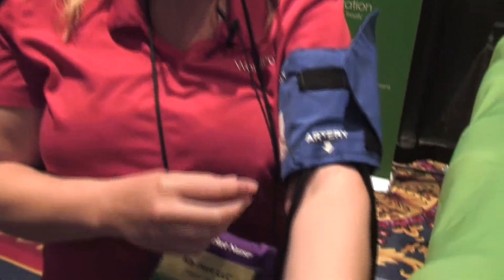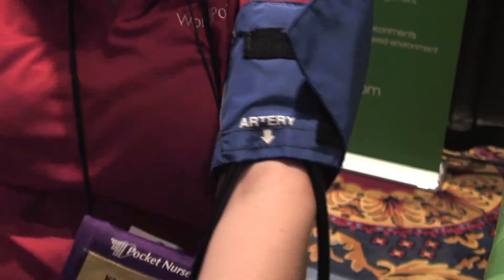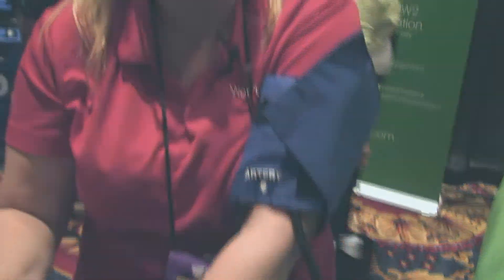So you can change any patient or any person — standardized patients, mannequins — you're able to change them into any type of heart rate and blood pressure that you would like them to have.